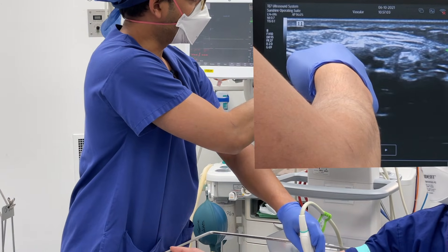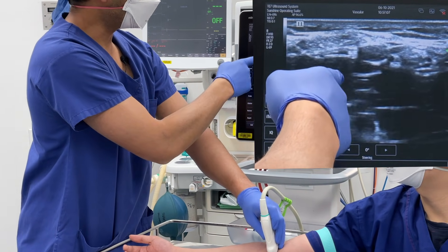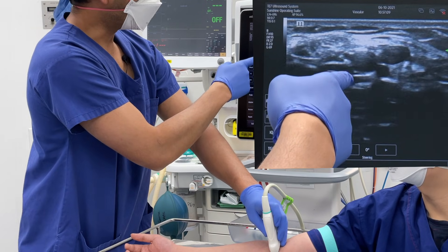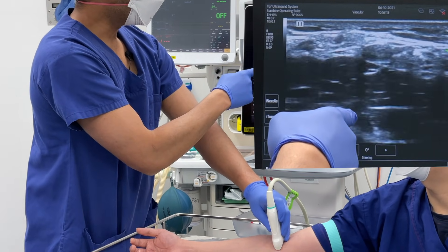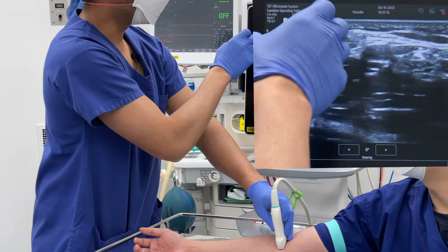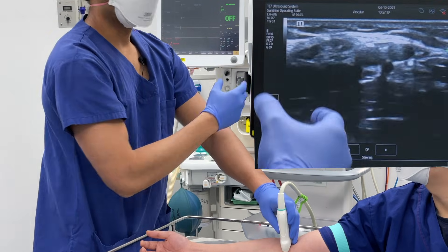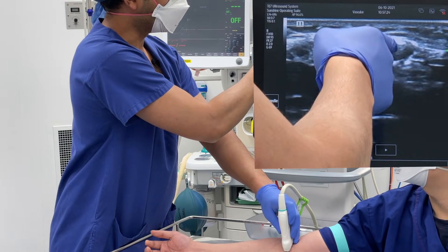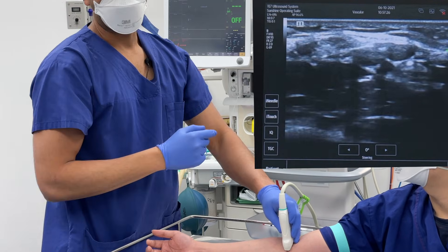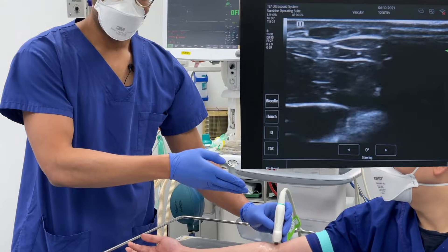Here's another interesting feature: you can see the two structures — the artery that's pulsatile, and as I take the pressure off, this beautiful big structure appears, which is the vein. The vein compresses while the artery next to it is pulsatile and doesn't compress as easily. In the most difficult situations, you'll need to be very accurate with your cannula to make sure it goes into the vein and not the artery.